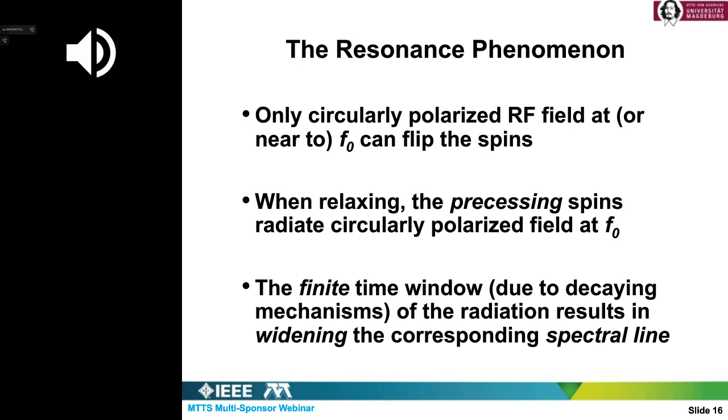But we will talk next about some loss mechanisms which make this resonance finite Q. Of course, if you don't have losses, Q is infinity. Low loss means high Q, high loss means low Q. Therefore, we borrow the same expressions we usually use in electrical engineering with resonators.